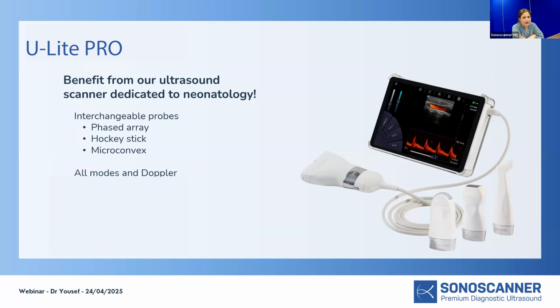But the problem may be in some patient populations where you have the RDS picture in the beginning. The tiniest babies are usually the ones who have a higher incidence of HSPDA, right? So how would you be able to distinguish between lung water from just RDS being resolved and HSPDA, which is more or less at the same time?